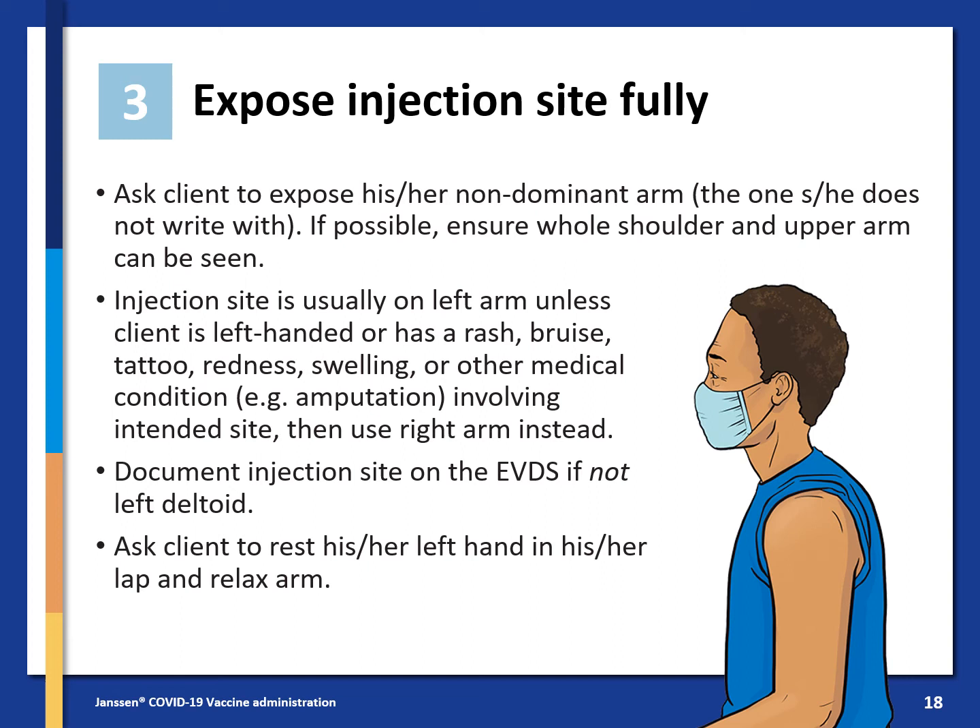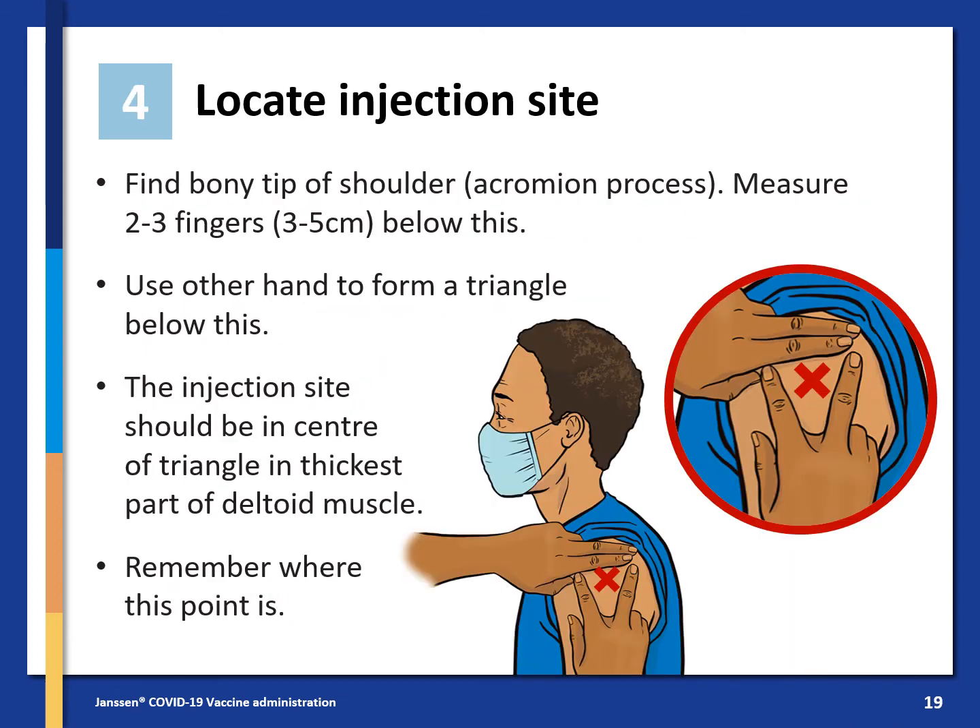Then use the right arm instead. Document the injection site on the EVDS if it is not the left deltoid. Ask the client to rest their left hand in their lap and relax their arm. Locate the injection site by finding the bony tip of the shoulder called the acromion process. Measure 2–3 fingers or 3–5 cm below this, and use your other hand to form a triangle below this. The injection site should be in the centre of the triangle in the thickest part of the deltoid muscle.